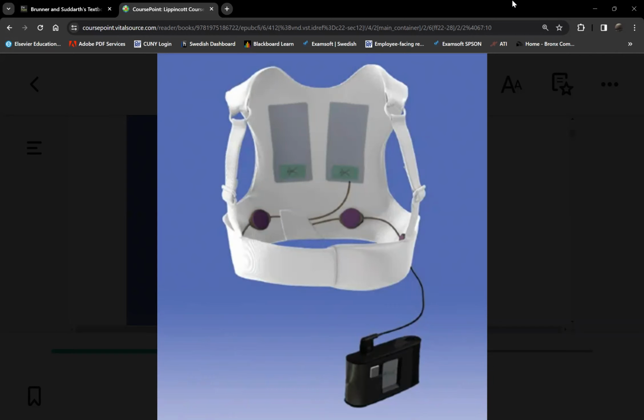Is this nice to wear? Let's say you're in Florida. Have you ever been in Florida? You know the weather there, the climate? Okay. Let's say you're a Floridian and then you're told, okay, put this on 24/7. Actually 23, because they're allowed to take it off during a shower. But pretty much it's on 23 hours a day. So do we have good compliance with this?